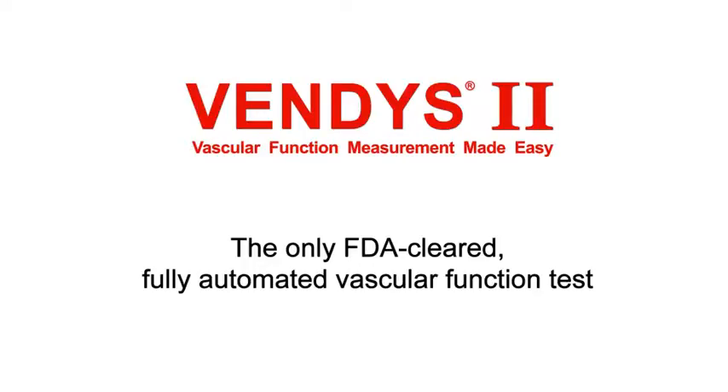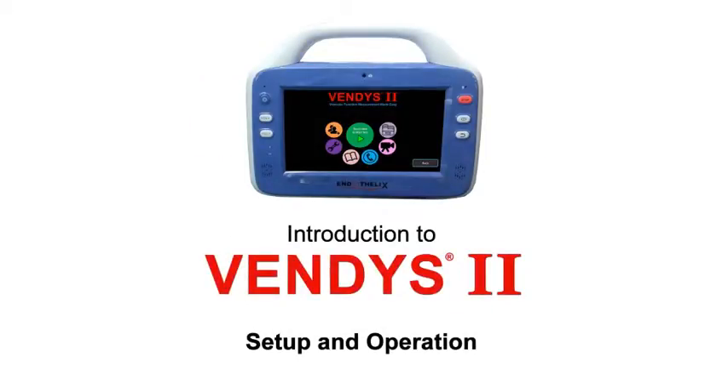Welcome to Vendis 2, the only FDA-cleared, fully automated vascular function test. Here we're going to introduce you to Vendis 2 and how to operate it.